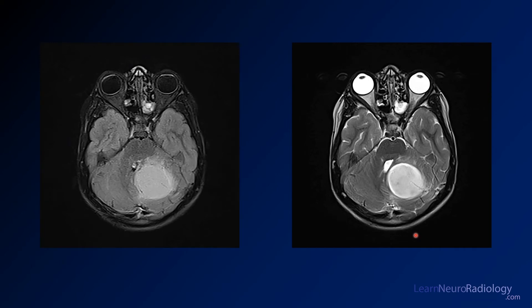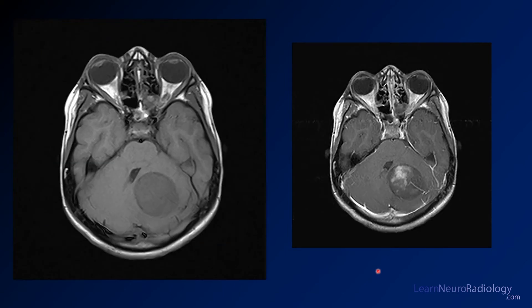Here are your FLAIR and T2 images. You have a FLAIR hyperintense mass in the posterior fossa, compressing the fourth ventricle over to the right. On T2, it's pretty bright with some surrounding edema. On pre- and post-contrast, you see it's low intensity on pre-contrast with some areas of heterogeneous enhancement centrally. This is not exactly the classic appearance, but by far, this is going to be the most common diagnosis in a child with a posterior fossa mass.